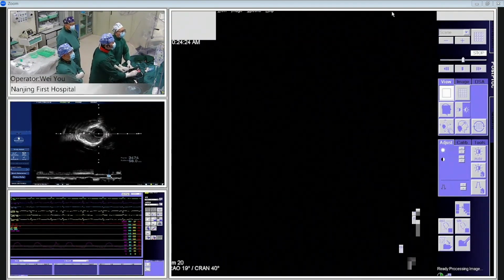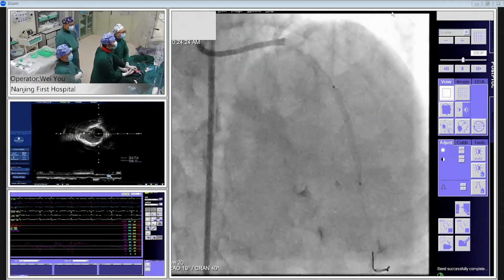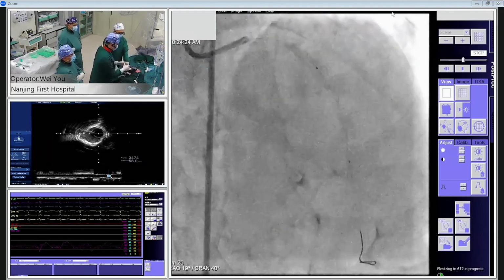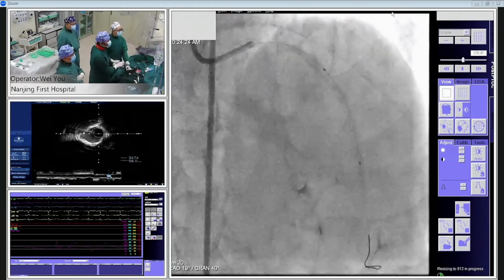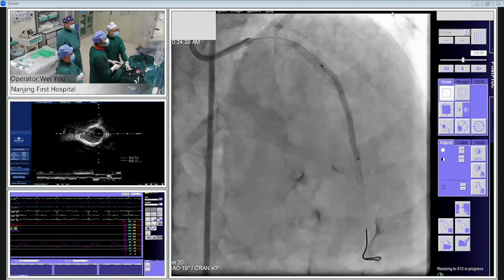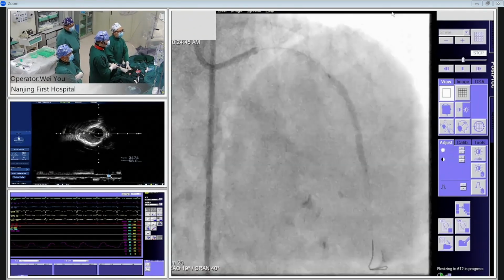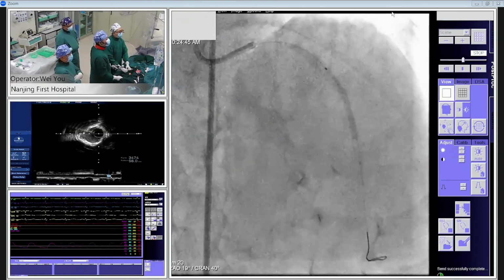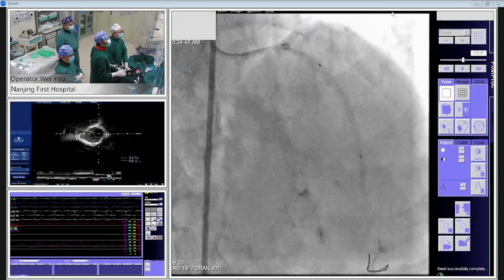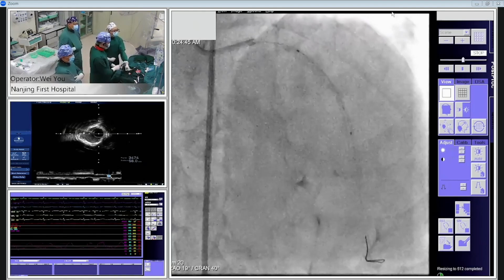We have given the stent. Wait a second, I will retrieve. Nice. Retrieve a little and do the post dilation. Please, long time inflation. Go, inflate. 12. We still use a stent balloon to do the post dilation up to 12 atmospheres to achieve full stent expansion. Of course, we still use an NC balloon to do the post dilation. Okay, go. 12.